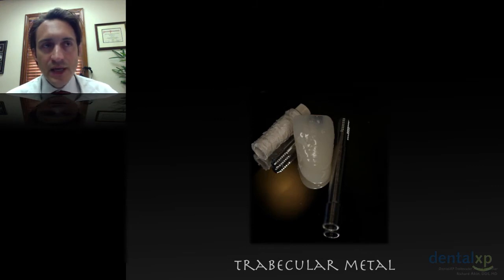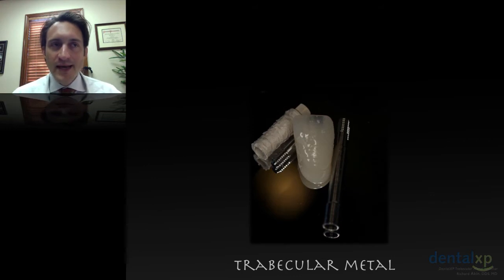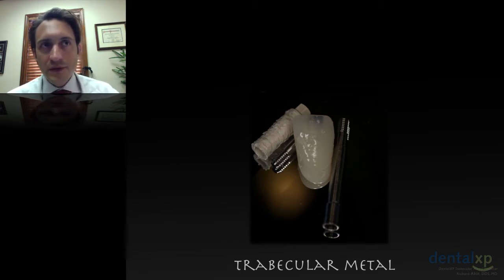Now we're going to get into some of the provisionalization. And I want you to see, these are the products that I use. My assistant gets these together for me, and she'll check the tooth shade, the size, and in this case I'm using a denture tooth. Denture teeth work very, very well for this, and they have just a wonderful color, and they hold up well during a 3 to 4 month provisional period. Occasionally we can load these implants early, but they provide a great solution and give us enough time for implant healing.